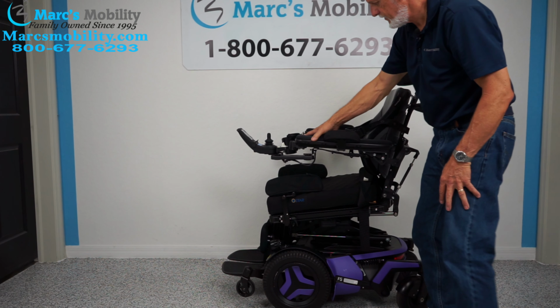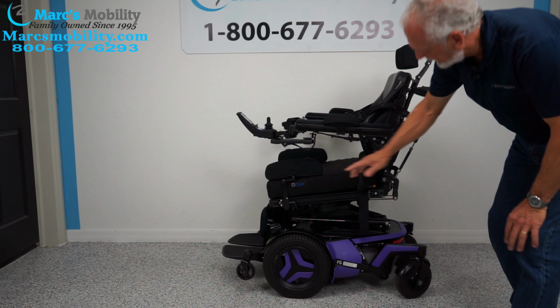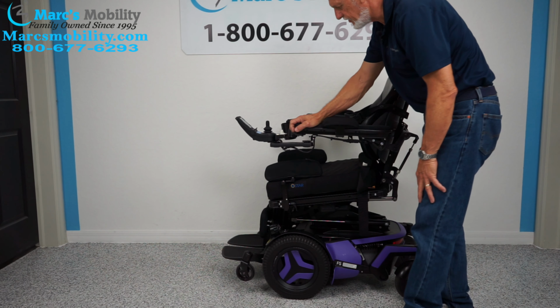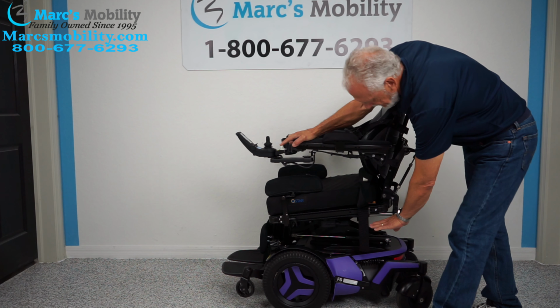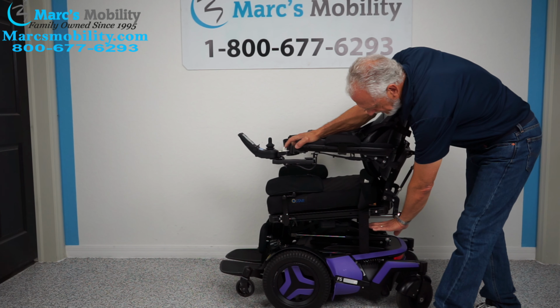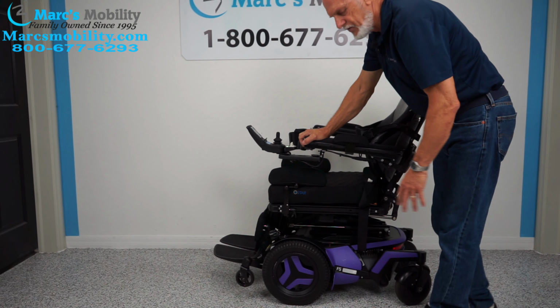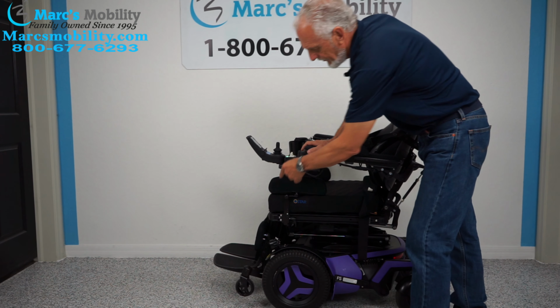So there we go. So now you can see the seat is no longer level, it's tilting forward. So it has a small anterior tilt to get you out of the chair if you needed to get out. Okay? So that's called your anterior tilt. You can see when I bring it down, you can see how the seat gets back down to my hand. Okay? So that's 6 electrical functions. The 7th electrical function are the feet.